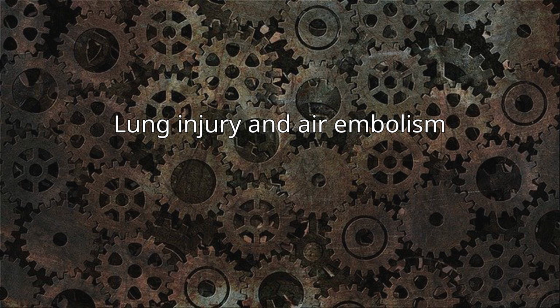Additionally, there is at least one report of manual resuscitator use where the lungs were accidentally overinflated to the point where the heart contained a large volume of air and the aorta and pulmonary arteries were filled with air, a condition called an air embolism, which is almost uniformly fatal. However, the case was of a 95-year-old woman, as the authors point out that this type of complication has previously only been reported in premature infants.